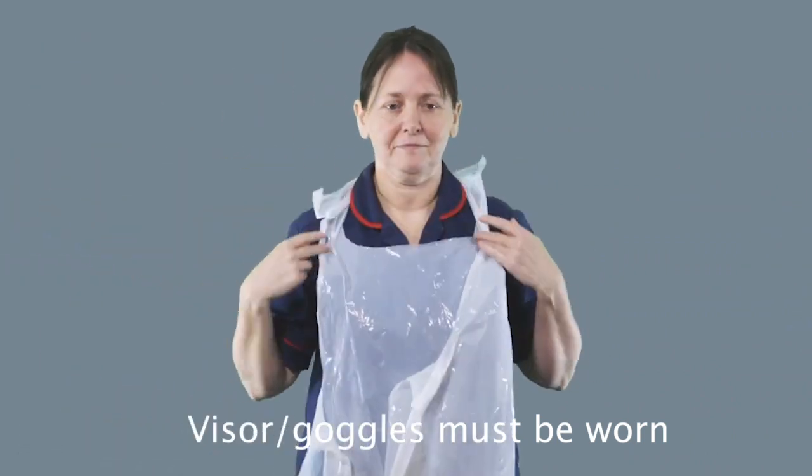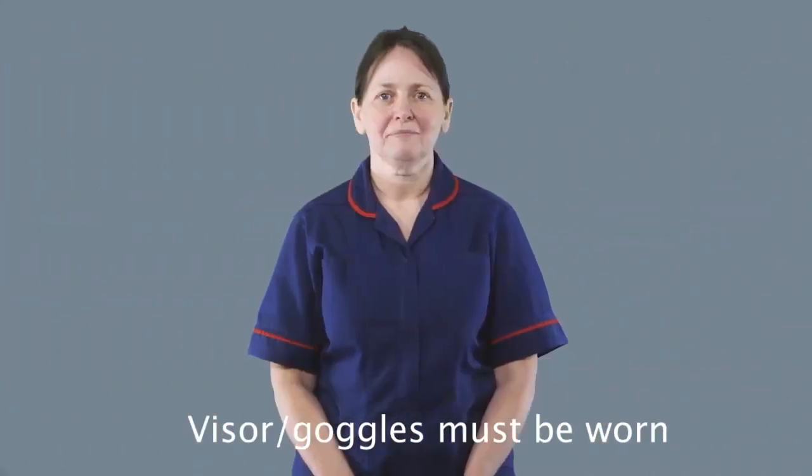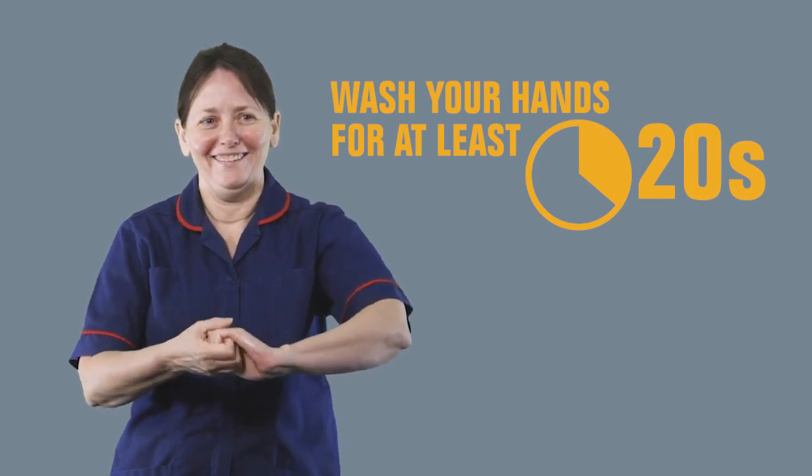The first step is to wash your hands or to use hand sanitizer. This will mean taking the gel or washing your hands for at least 20 seconds.